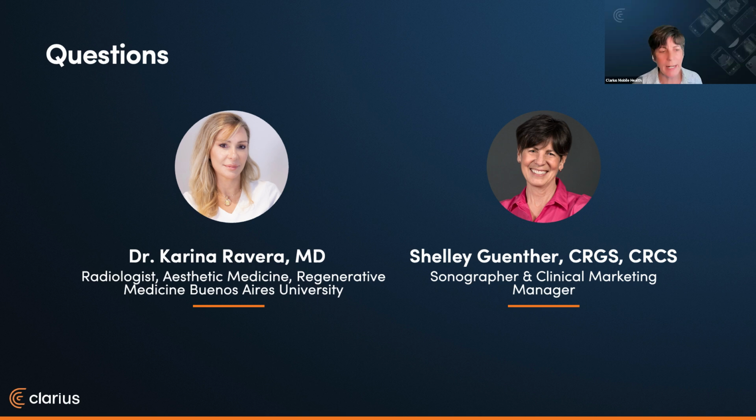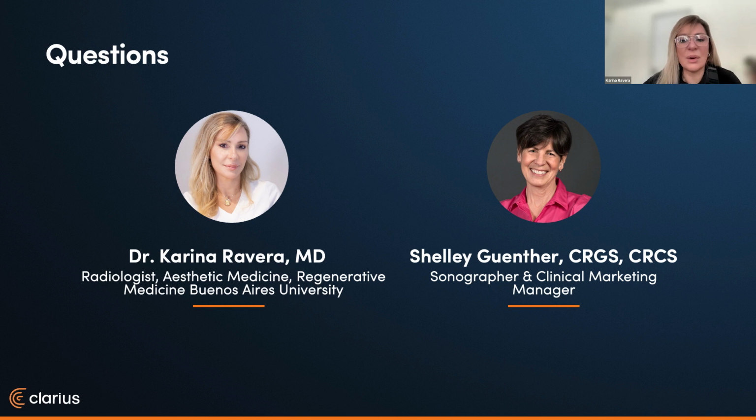Yes, and I also find too that if the T-mode's not working, maybe try to adjust your scanner position. It's almost a way to help you improve your technique a little. So if you don't have good contact or you're not perpendicular to the skin surface, the T-mode won't register as well. So if you get a good ultrasound image, then the T-mode should work as well. We have to do a correct orientation of the probe, yes. Correct, yeah.